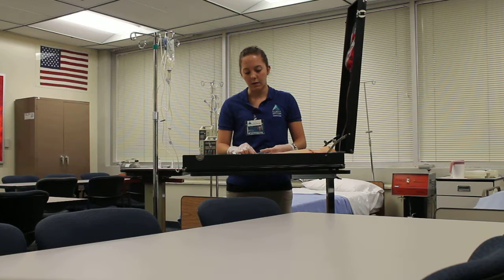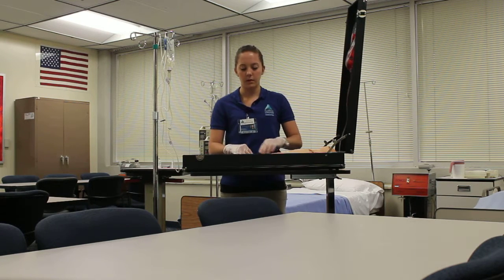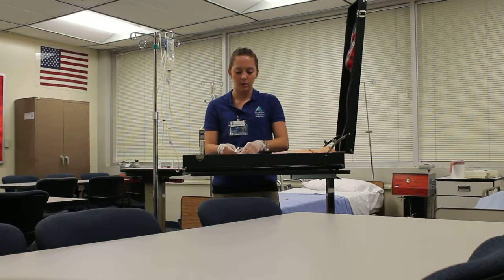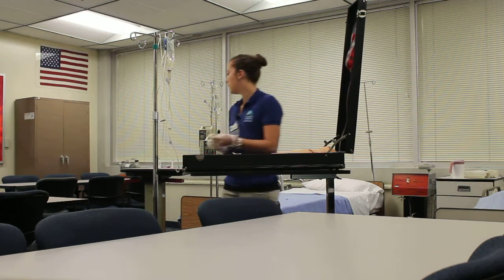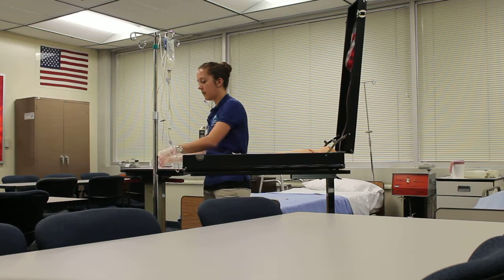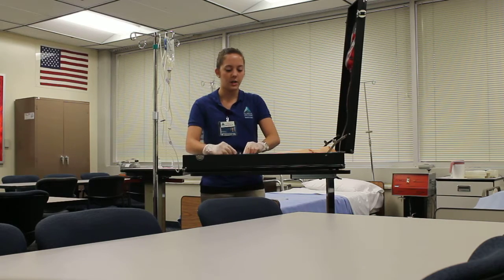For every half a ml I push, I'm going to stop. And I'm going to continue that until I finish the 3 mls. Okay, I'm going to reclamp the tubing and disconnect my syringe, throw that in the sharps, and clean up my area. I'm going to check the site again for phlebitis or infiltration.